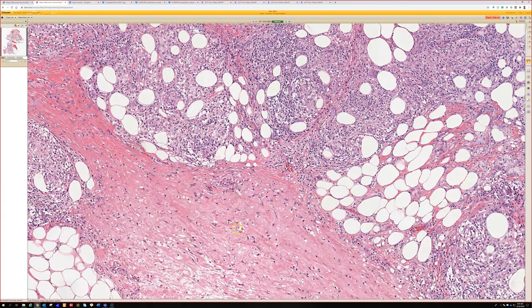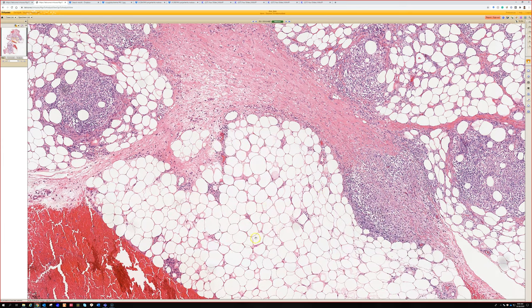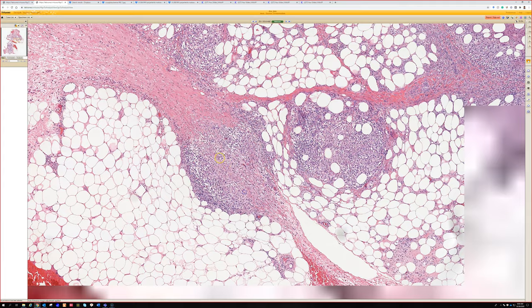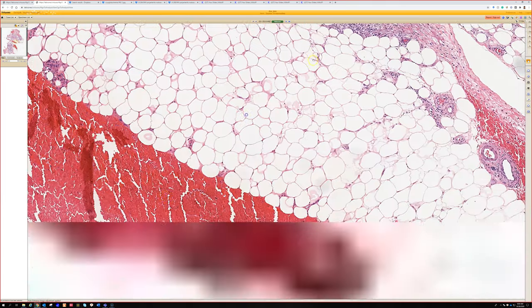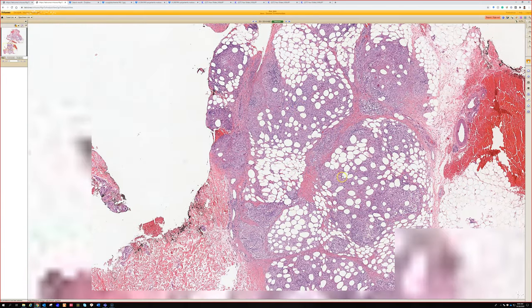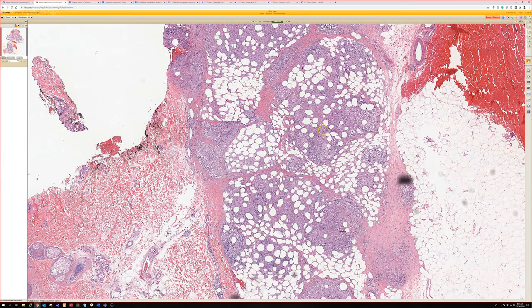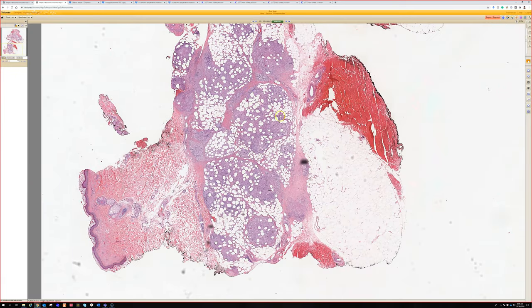The main thing here is you've got to exclude infection — this could easily be an atypical mycobacterial infection or deep fungal. So you'd need to do stains and cultures to make sure there's no infectious etiology. I looked around at this slide earlier and could not actually find good vasculitis here — and that's a feature you're supposed to have, although some studies suggest you can sometimes not have vasculitis in this. This is predominantly lobular, although it also has septal widening — so it's kind of septal and lobular.